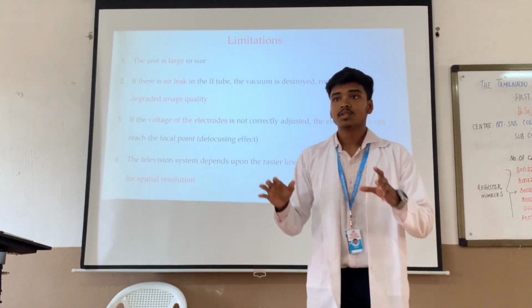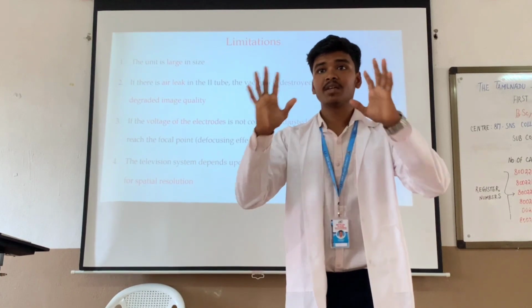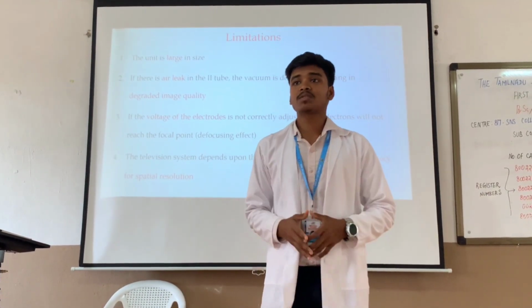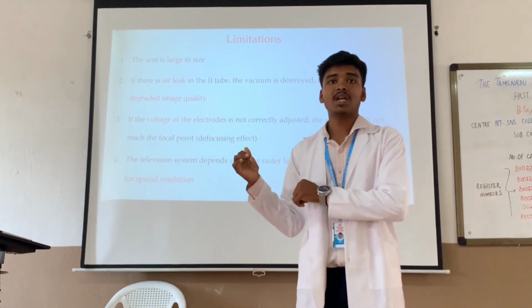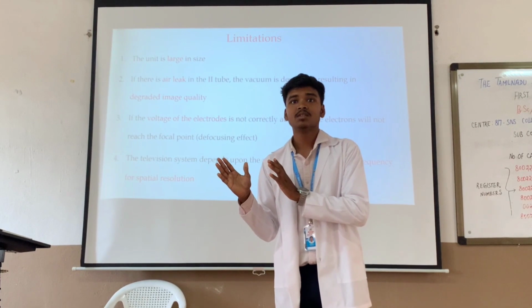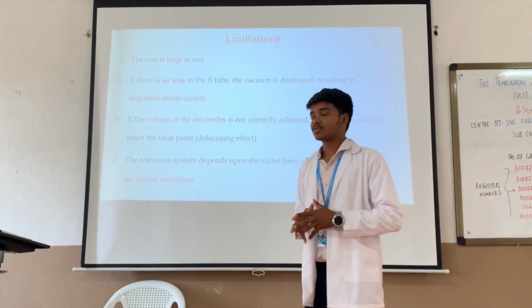So I said, for the focusing electrodes you have to give a constant power supply. If you do not give a constant power supply, it does not move the electrons towards the anode. So you have to give a constant power supply.